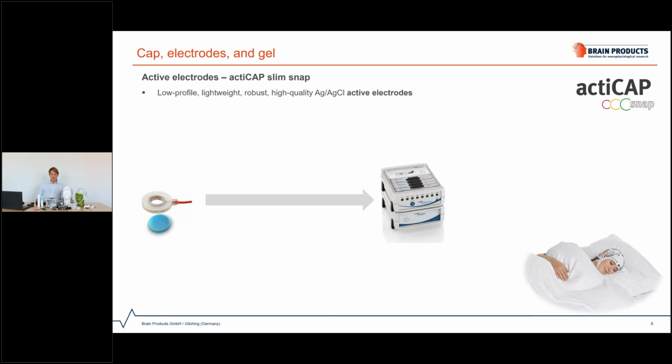The problem is that the electrode and the cable act as an antenna, so together with the signal of interest, they can also pick up noise coming from the mains, from other devices, from cable movement. This is problematic because it spoils our signal of interest, hence reducing the signal-to-noise ratio.